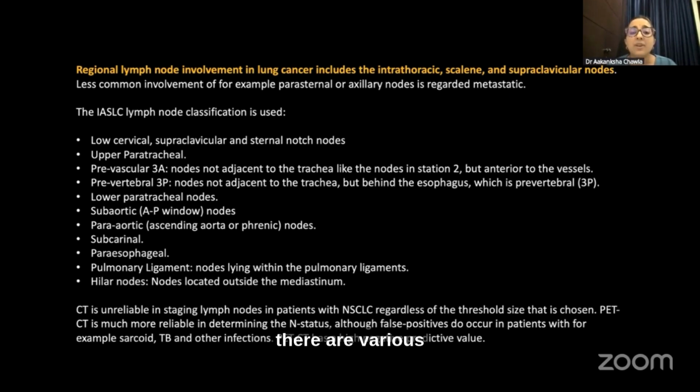Remember, there are various investigation modalities through which you can approach these tumors. Like you can do EBUS, endobronchial ultrasound, transbronchial needle aspiration, that we do as pulmonologists as well, which is for your lymph node stations 1, 4, 7, 10, and 12. Then EUS, that is your esophageal ultrasound. For that, you do your stations 7, 8, and 9.